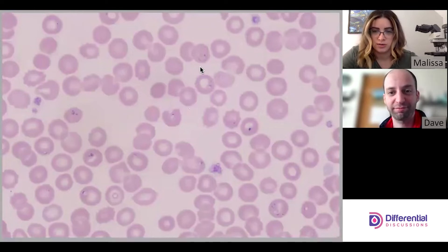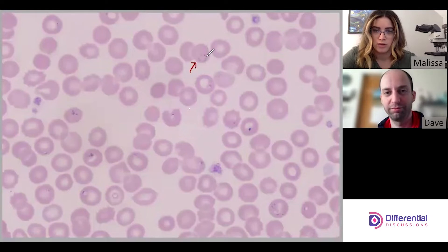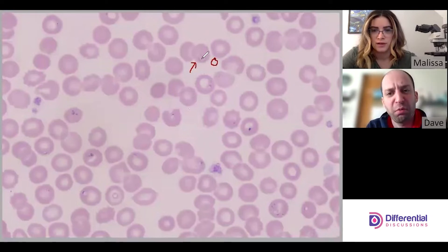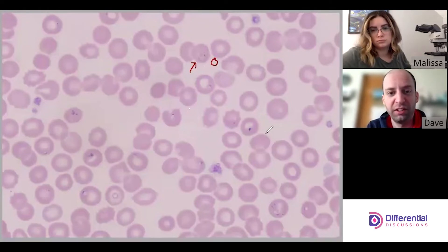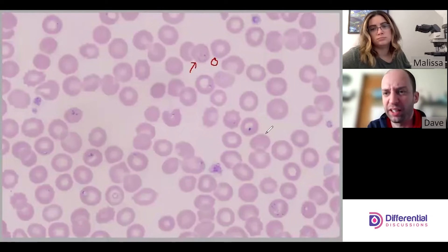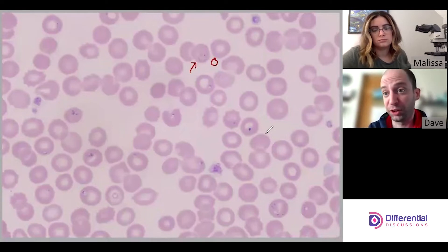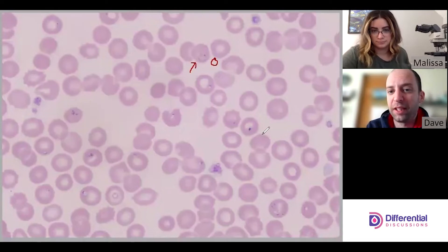The first one we should start with is here, just because it's a really nice clear ring form where you have the chromatin dot right here and then a nice ring around it — beautiful. One of the stranger points about Babesia morphology is the variation. Because that one is beautiful and one might find it difficult to distinguish versus a Plasmodium species in a vacuum.